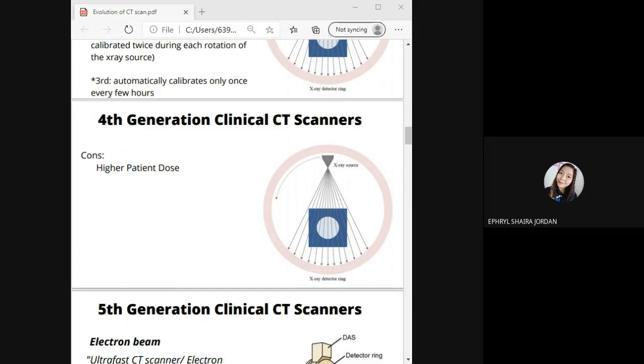So this requirement allows for scattered X-ray to reach detector elements and distort the scan data, with no simple method of reducing this problem. Scatter can be corrected for using post-processing algorithms or reference detectors, but both of these corrections carry the caveat of increasing the time taken in reconstructing images.